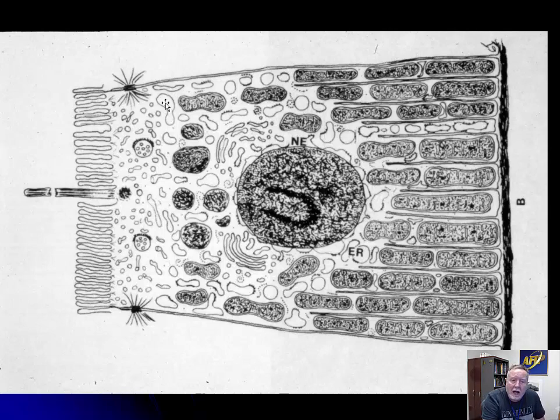stressed. And remember, look closely. Remember I said that one of the very characteristic signs of the early parts of cell swelling is that the nuclear envelope becomes dilated. And that's what we're seeing here. You know, I've seen a lot of smooth endoplasmic reticulum. I couldn't tell whether it was dilated or not, but when I saw the nuclear envelope being dilated, I knew that I had a stressed cell. But the organelles are all in the right place. They're not going anywhere.